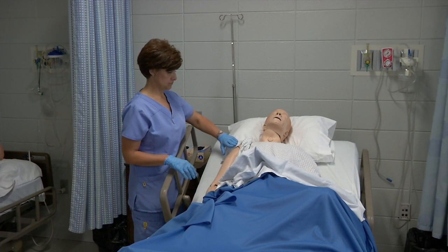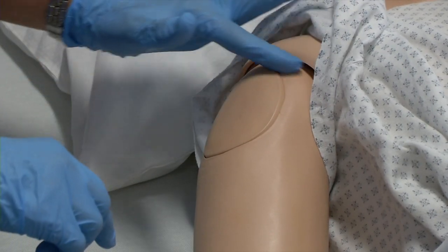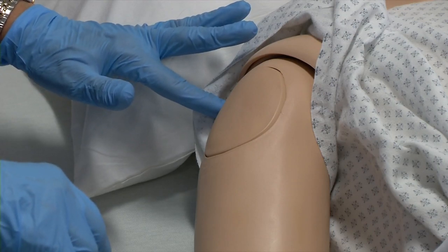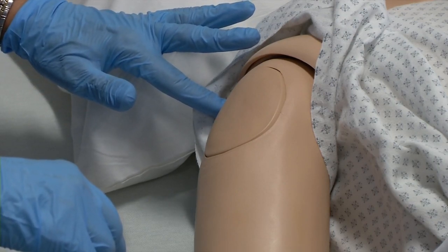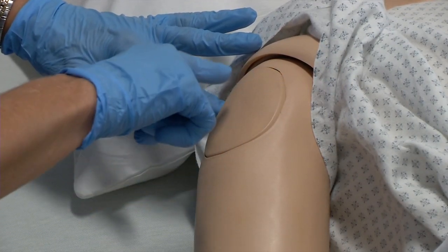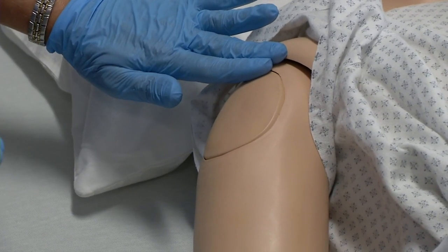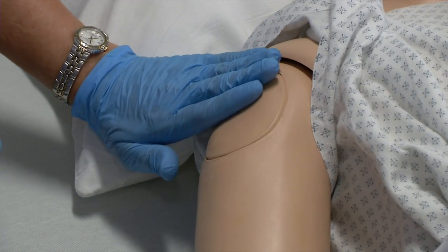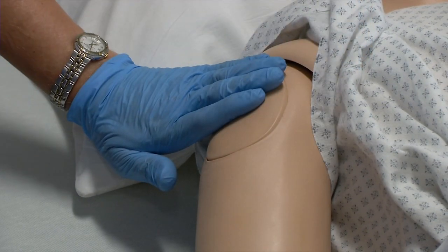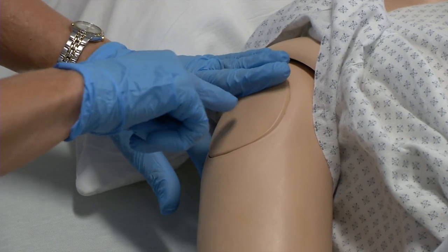Palpate the lower edge of the acromion process, which forms the base of the triangle in line with the midpoint of the lateral aspect of the upper arm. The injection site is in the center of the triangle, about 1 to 2 inches below the acromion process. You can also locate the site by placing 4 fingers across the deltoid muscle with the top finger along the acromion process. The injection site then is 3 finger breadths below the acromion process.